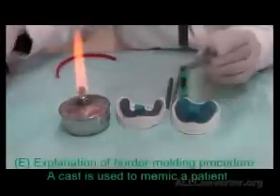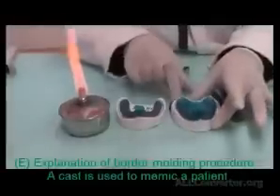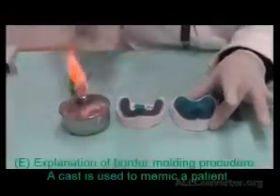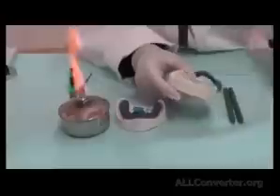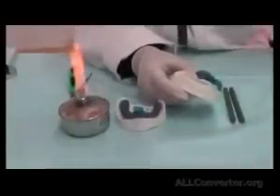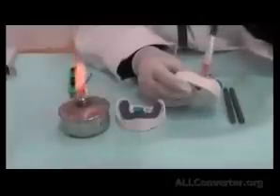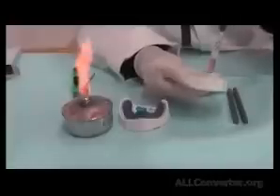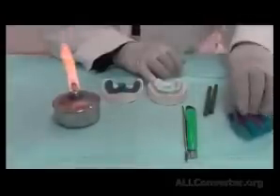For your case, because this is a lab procedure, we don't have patients today, we're going to use your casts as the patient. These will demonstrate the patients now. So we're going to suppose that this is a patient, not a cast. So we want to make sure that compound does not stick to it. So we're going to paint the cast borders using a very minimal amount of Vaseline. Just minimal, a very thin film, meaning that it's invisible. So if you look closely, you will not see a layer of Vaseline there. It will only be a thin film of Vaseline painted on the areas where green stick will be touching. So once we finish, we are now ready to do border molding.